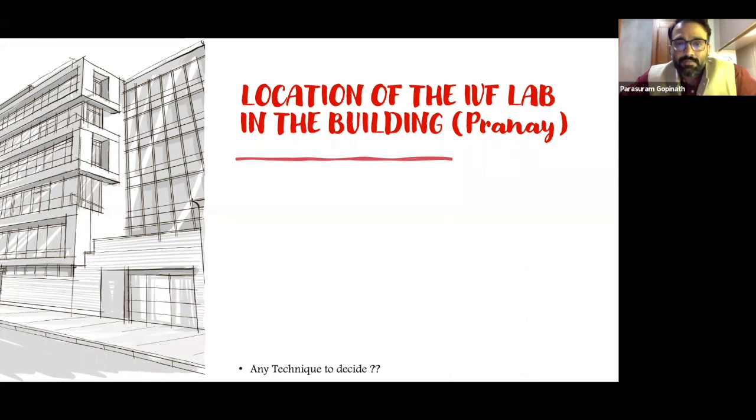Yeah, thank you for the question. This is one of the most important parts of setting up an IVF unit, because this is the make or break. You can change anything in a lab, but you cannot go back in time and change the location of the lab. So once you've decided where you're going to set up your lab, you need to be mindful of the zoning requirements, and of the permits and permissions required by the local council or the government, because these might restrict what can be done on the site later on. So have these in writing.